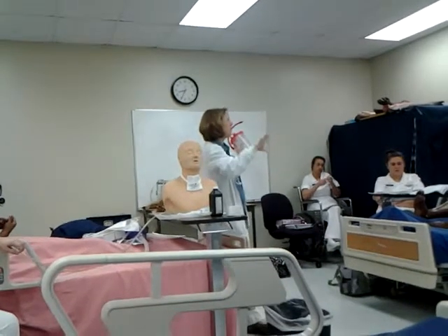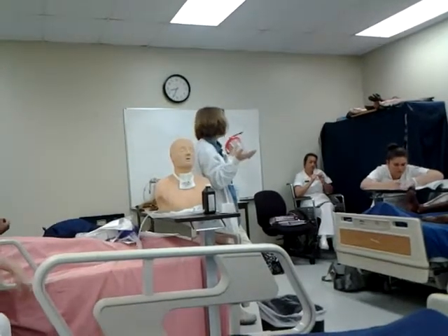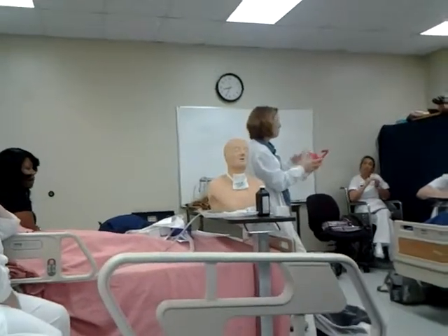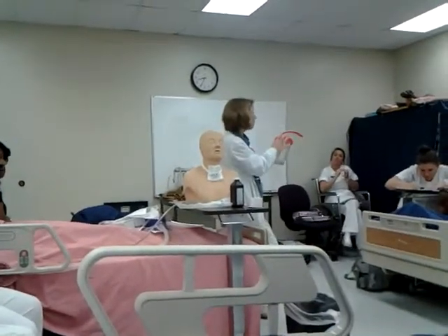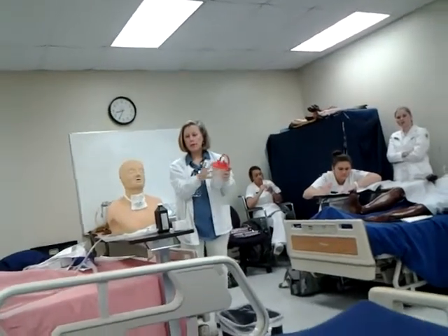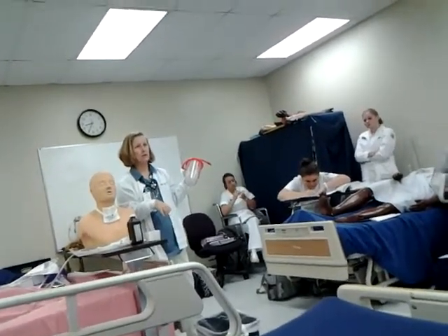And we would not have to put that in the nurse's note at all unless it was bloody or unless there's something unique about it. Same thing about the urine, if it was cloudy and foul odor, and I would include that in terms of the numbers really on that graphic sheet. About how much saline do you usually use? You may need more than what you put here. It depends on the patient. Depends on how thick their secretions are.